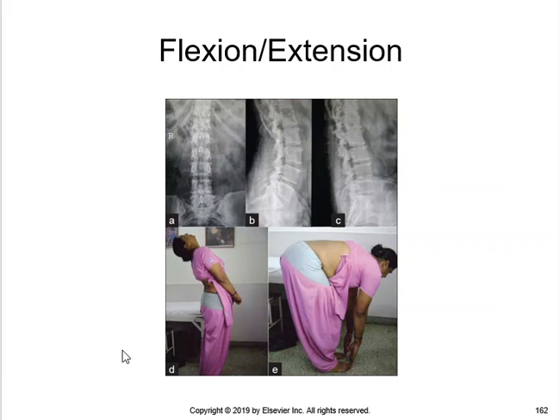So flexion extension views kind of look like this, although they have this patient bent over. This can be done, but you need to understand that most of that flexion, that's not all back flexion, that's mainly hip flexion. Good extension, but our flexion here, our spine is certainly going to straighten out, but you can get a better flexion without having the patient touch their toes.